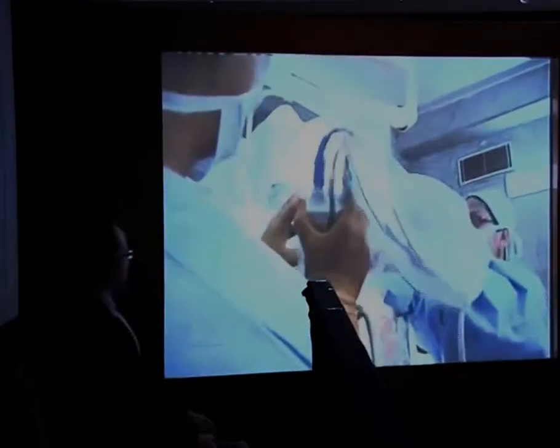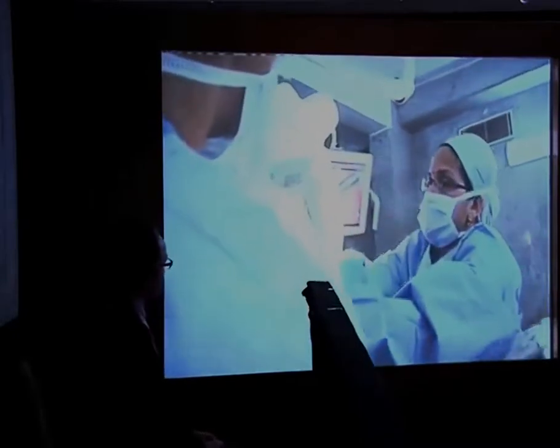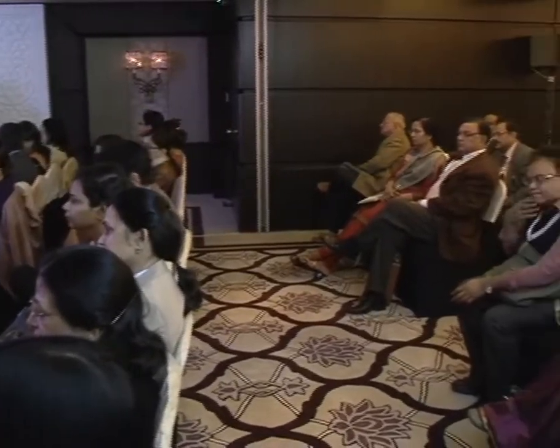All right, I'll take the monopolar scissor on the other side. I'm going to step in front of you. This is the PK we were talking about. We're just getting our instrument arms situated here.